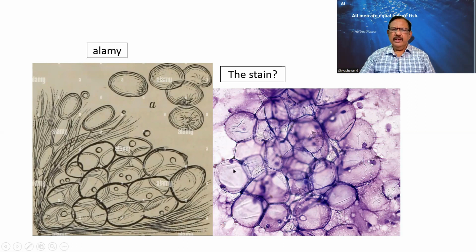This is a stained picture of it. I am able to see again a vacuolated cytoplasm, a peripherally pushed nucleus, empty cytoplasm over here, and the cells are all seen in clusters or sheets. So this is the adipocyte, or the fat cell, we had seen in the last class.